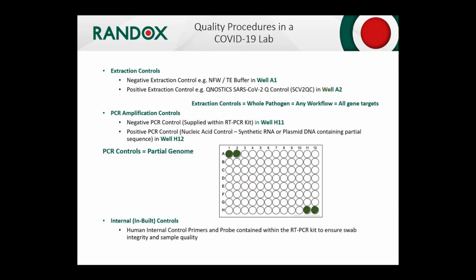They're looking at the bottom limit of, say, your clinical range, maybe below that to the lower limit of the machine, and then beyond that to the upper limits of the clinical range, and then beyond that the upper limits of the machine. Is that what you're telling me? Yes. The analytical Q panels have been designed to cover the dynamic range of the assay you're using, which allows laboratory managers to assess the linearity, LOD and LOQ.